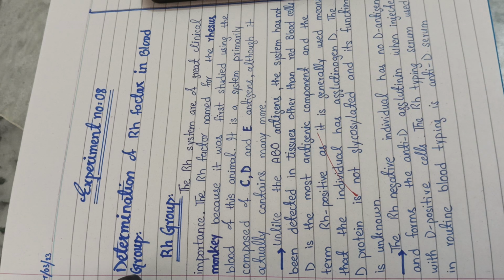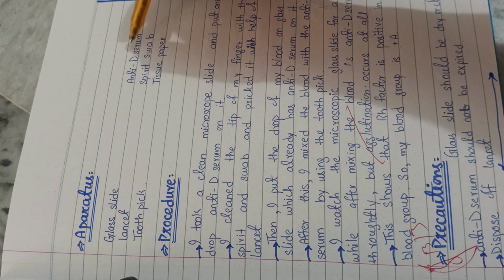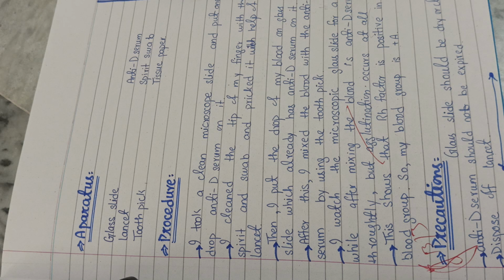Now moving on to the next page. The procedure is very similar to the previous experiment, with just the difference of anti-D serum. In the previous experiment we took the anti-A and anti-B serum, but in this experiment we take anti-D serum and mix it, and after that if agglutination occurs, it means you are Rh positive.